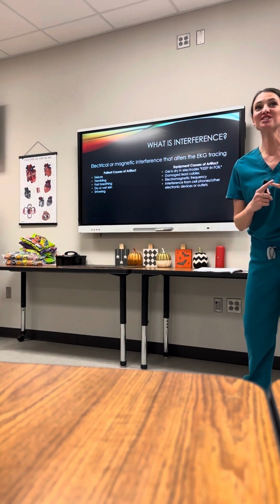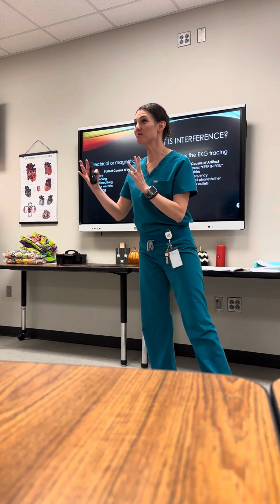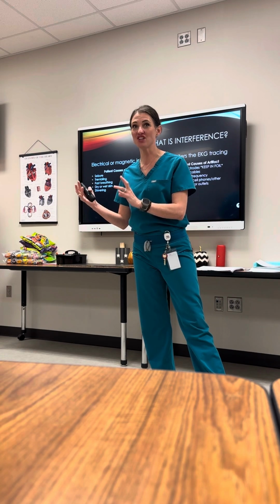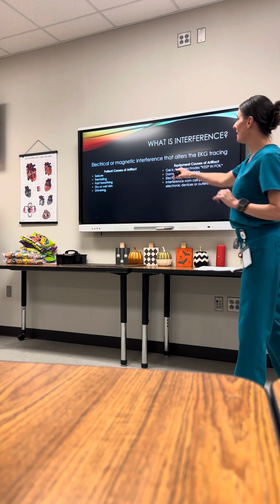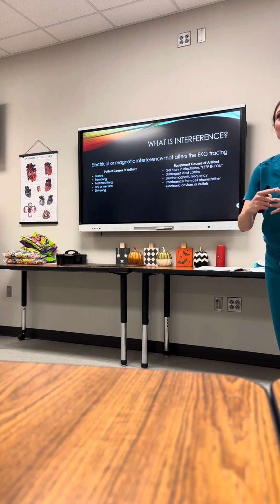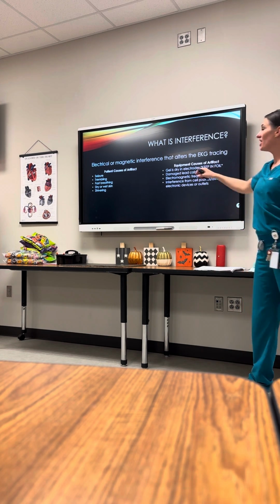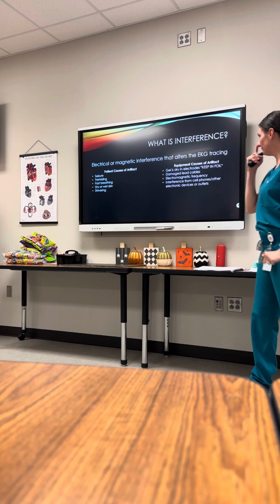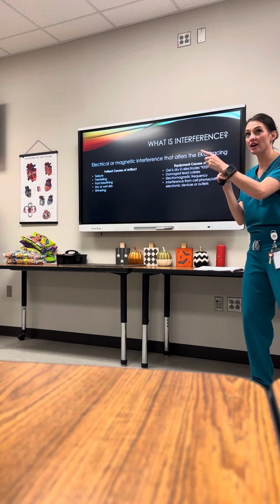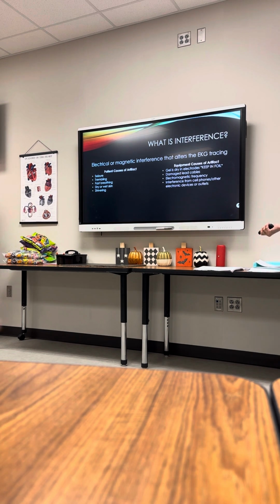Okay, guys, sometimes it's the patient who caused artifact. Sometimes it's the machine or something else outside of the patient that can lead to artifact. Patient causes would be seizure, trembling, fast breathing, dry or wet skin, or shivering. Equipment causes: the gel in the electrodes has dried out. That's why they're in those little foil packs when you grab them. Damaged lead cables, electromagnetic frequency or interference from cell phones or other electronic devices or outlets. We have to write all of those.